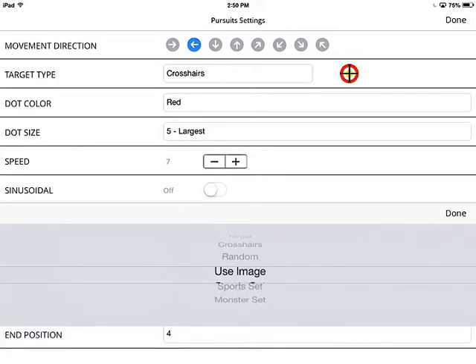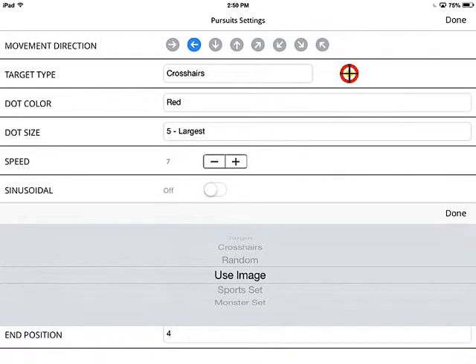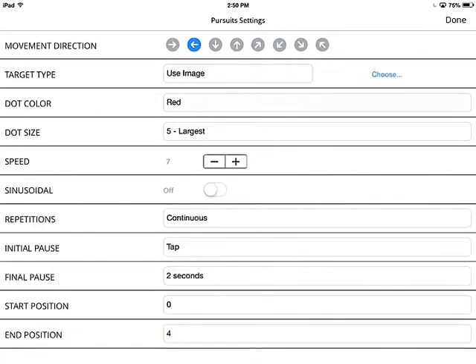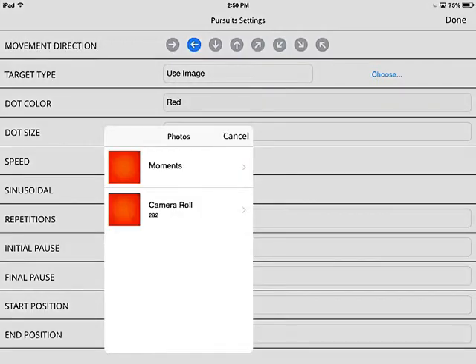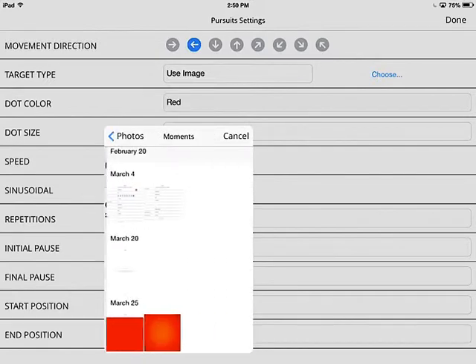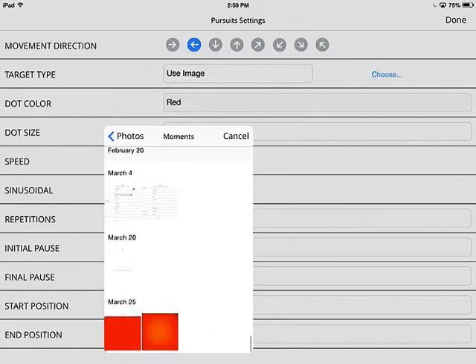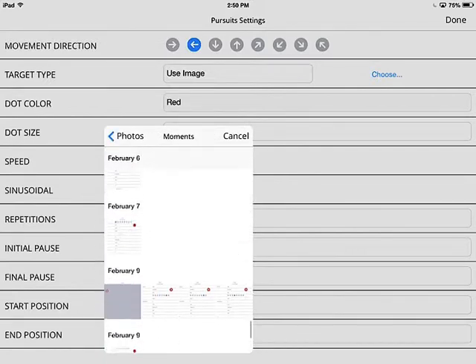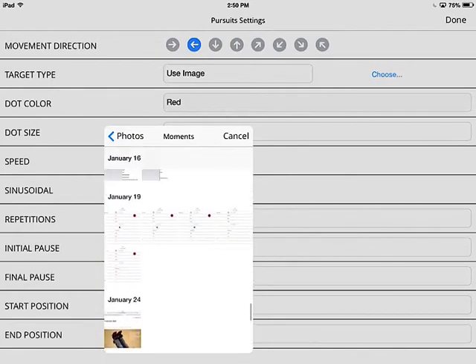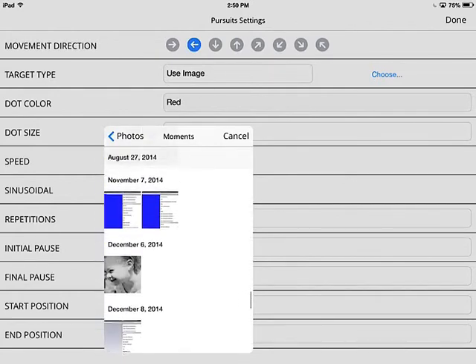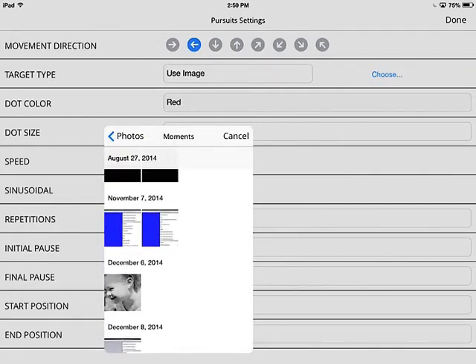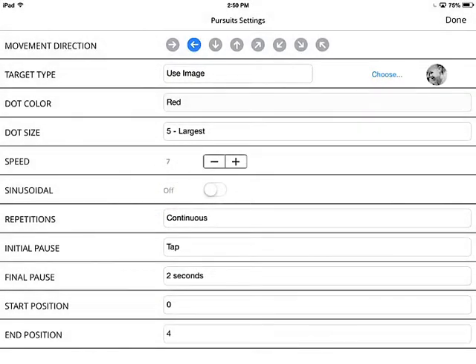You also have a random option, and you can use one of your own images — you can actually upload an image. If you press choose, you can select an image to upload. I'm just going to pick one of my favorite pictures.